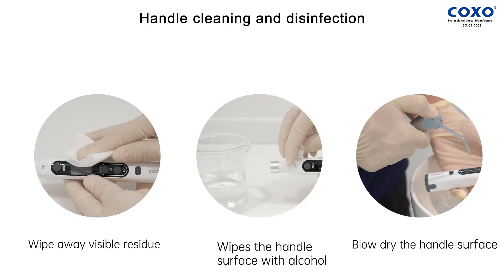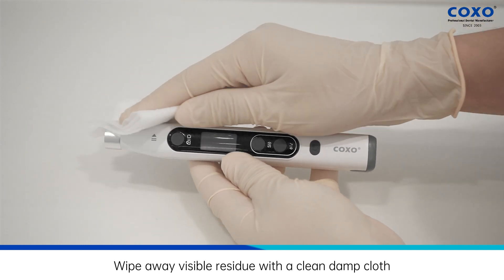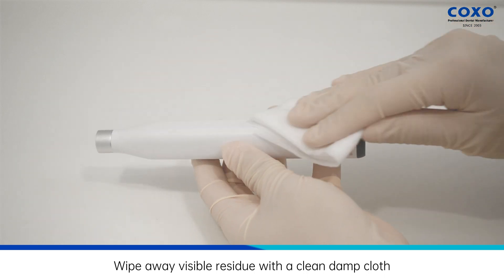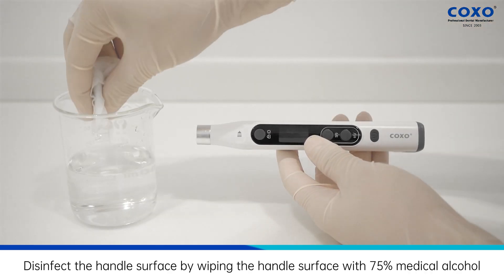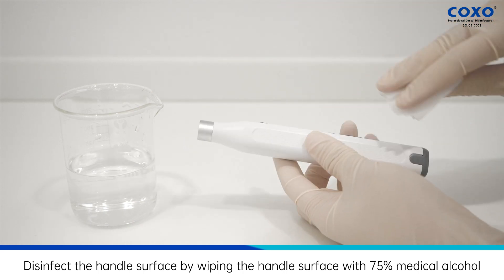Handle cleaning and disinfection. Wipe away visible residue with a clean, damp cloth. Disinfect the handle surface by wiping with 75% medical alcohol.